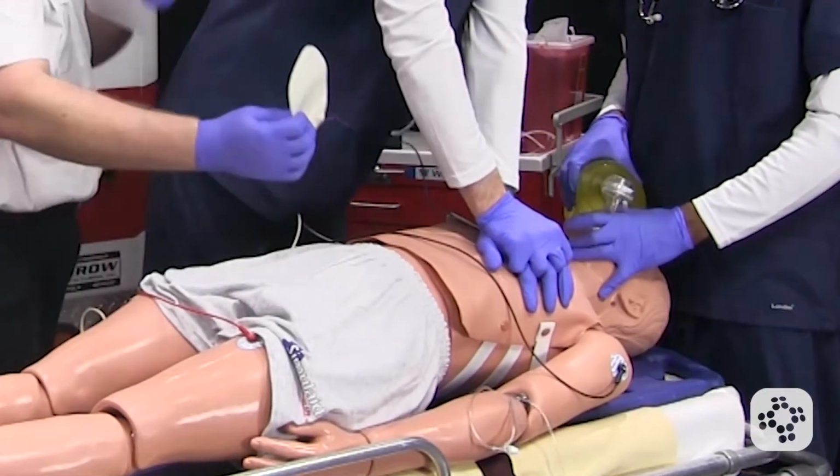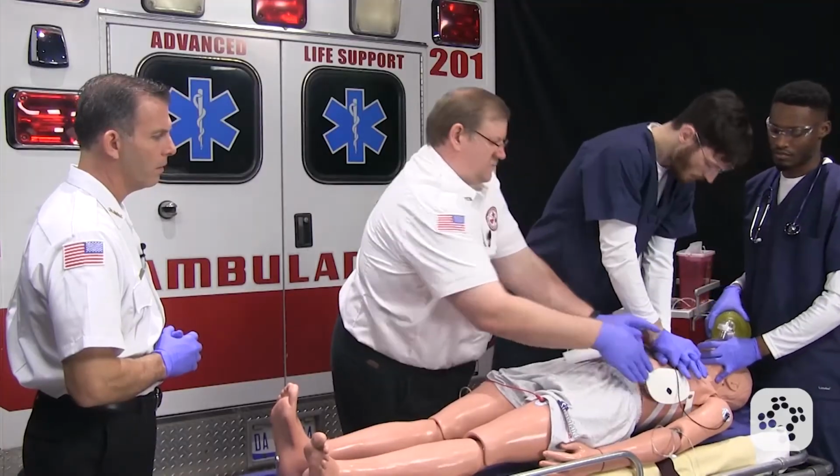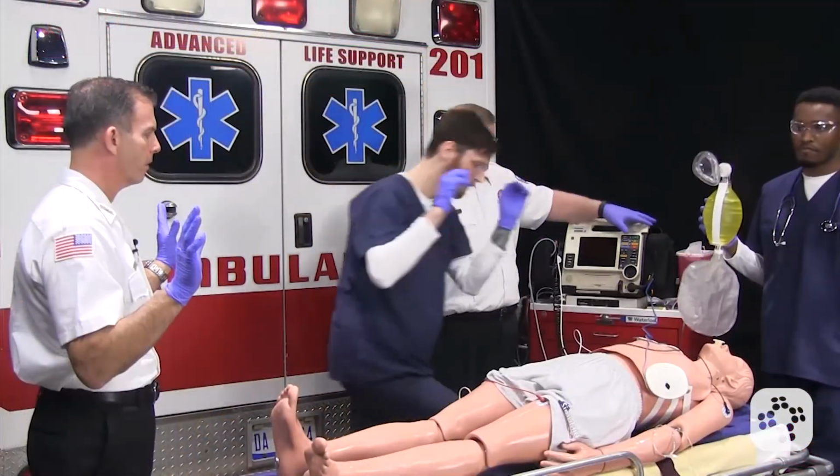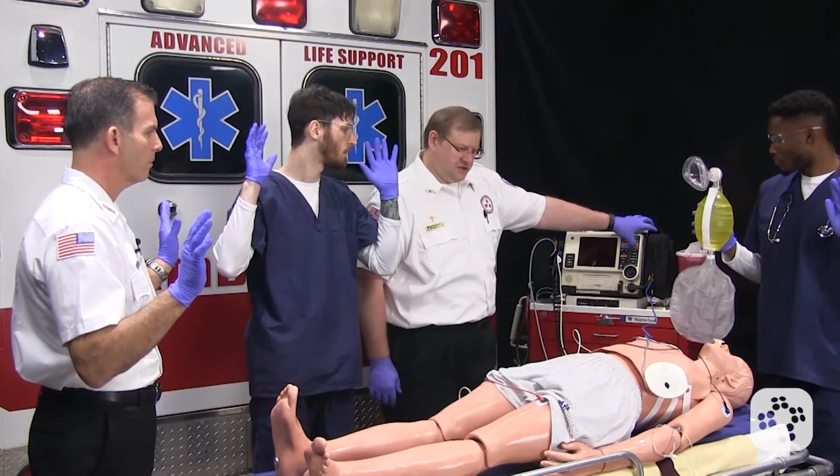The defib pads are applied while CPR is in progress. When the pads are in place, the leader will tell everyone to stand clear while the rhythm is analyzed. VFib is still present on the ECG. With a monophasic defibrillator, we're going to go ahead and charge to 360 joules to shock our patient, and CPR is then continued. Since we have VFib, the first shock has been given, and an IV is established.